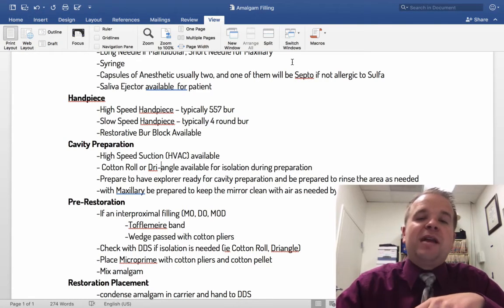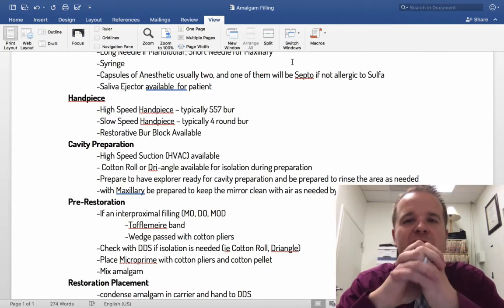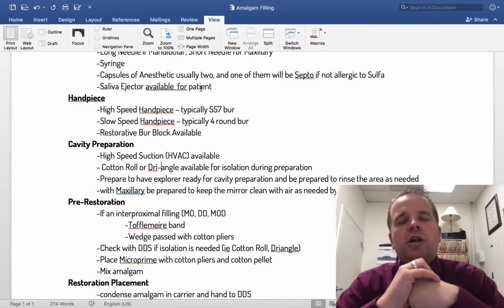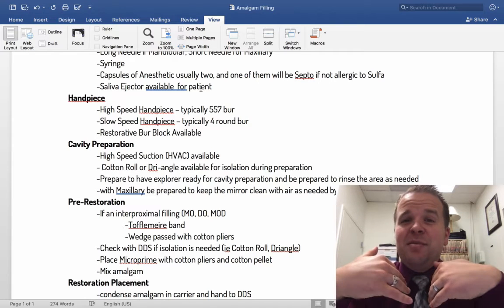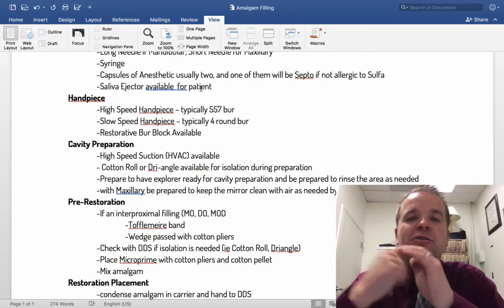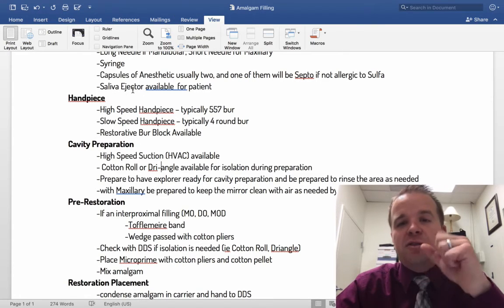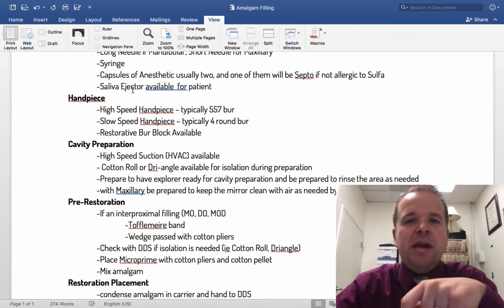And then what is going to happen is once you take out the numbing gel, usually you like to have the patient close down the saliva ejector, which is what we call Mr. Thirsty, where it sucks out all the saliva. That way they don't have to swallow their saliva that has the numbing gel in, and it gets their throat kind of numb. So we don't want to do that. So as soon as we take that out, we want to have the saliva ejector ready to go so that you can just close around the patient. And then at that point, that's when the doc will go in and numb them up.